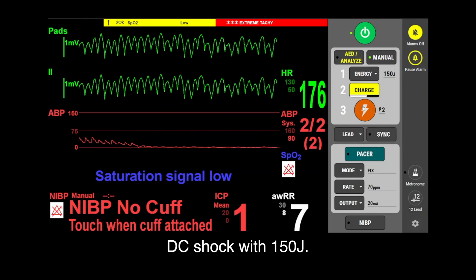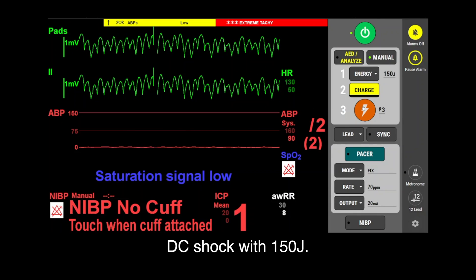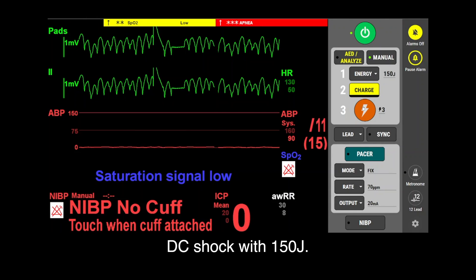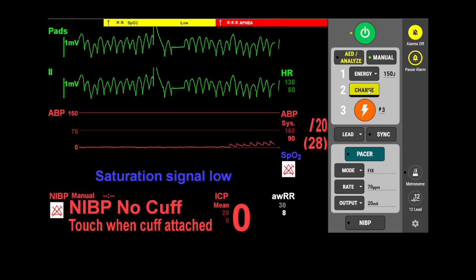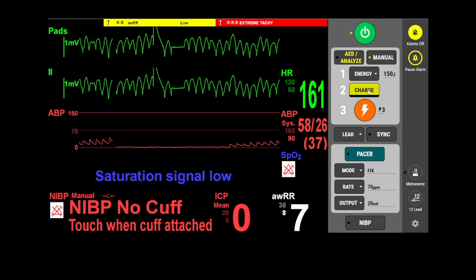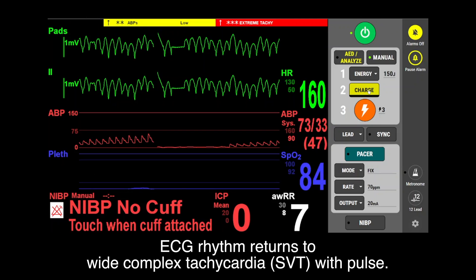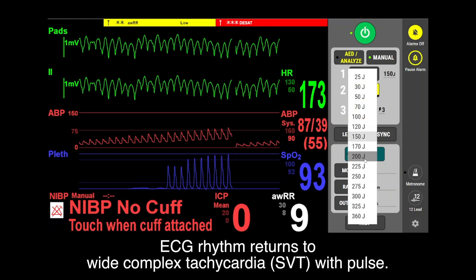DC shock is applied with 150 joules. The ECG rhythm returns to wide complex tachycardia with pulse.